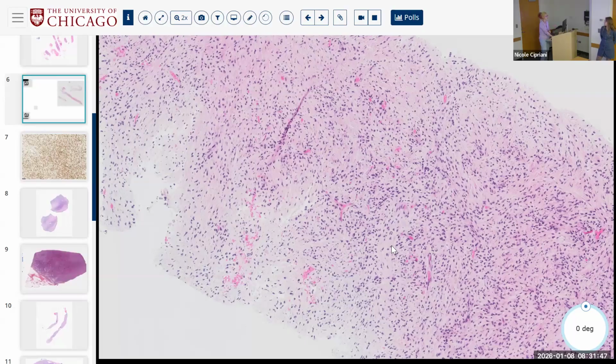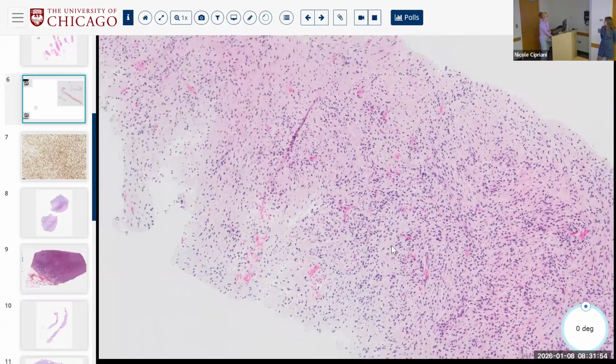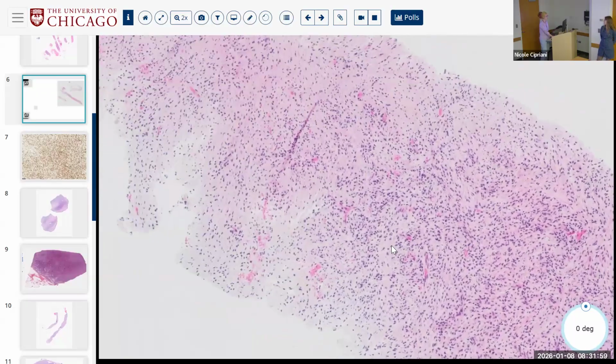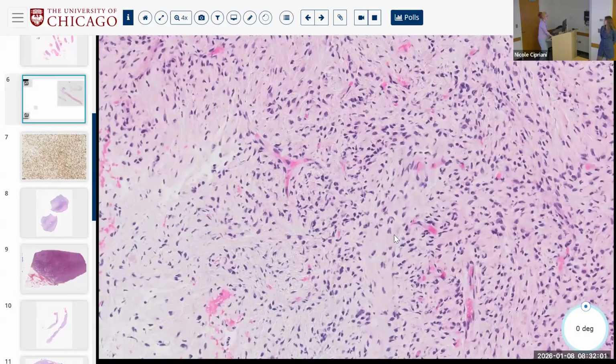So that will be different by staining. CD34 for the myofibroblast first? No. SMA for fibroblast, myofibroblast, okay. And then what for nerve sheath? SOX10, S100, GLUT1, EMA. Okay, so SOX10 or S100 for Schwann cells, EMA for perineurium.